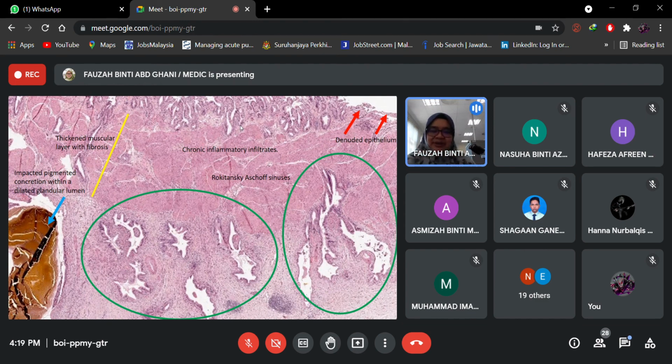So this is just one section. If we could look at this in continuity, at some point it would actually be continuous with the mucosa above. So this is actually in continuity. We see it only up to here, but if we follow it further, it will continue here. It's just that the glands burrow deeper and deeper and deeper because of the chronic process.